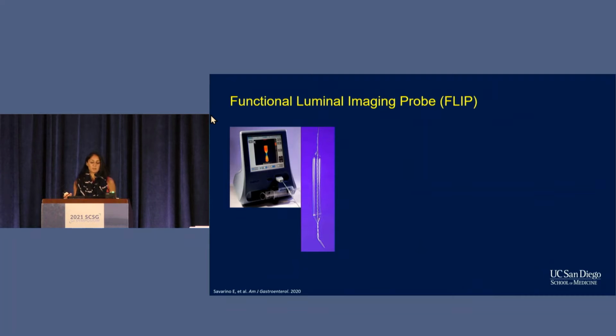So what is FLIP? This is a picture of FLIP version 1.0. This is what I started working with when I was at Northwestern in 2013, actually with my mentor who really pioneered a lot of this work, John Pandolfino. He's going to be talking tomorrow about esophageal physiology. The FLIP system is connected to a catheter that has 16 impedance sensors and a single pressure sensor, and these are all surrounded by a balloon.